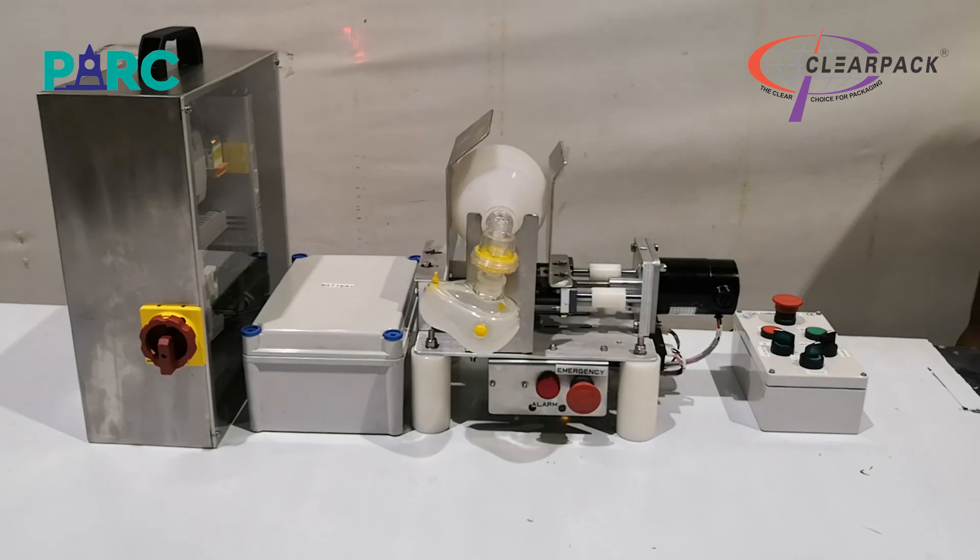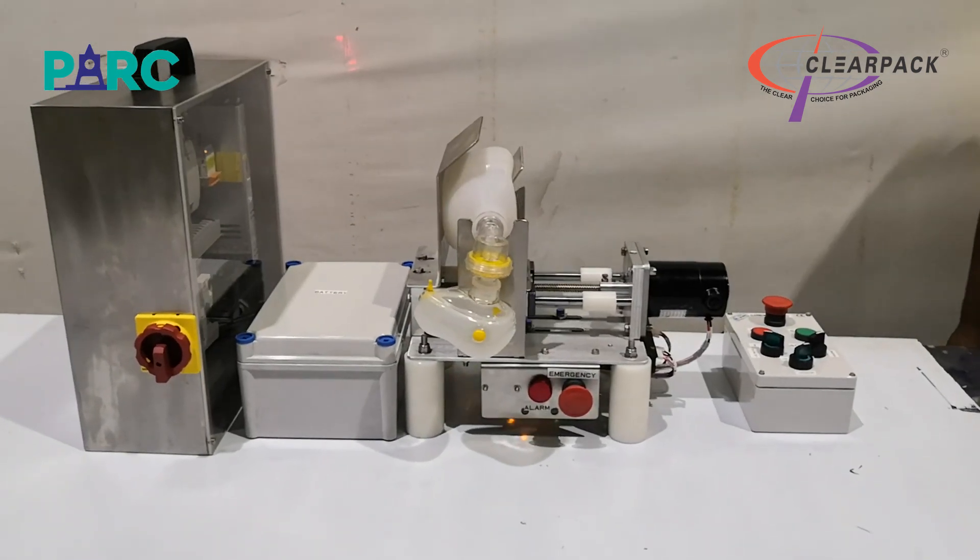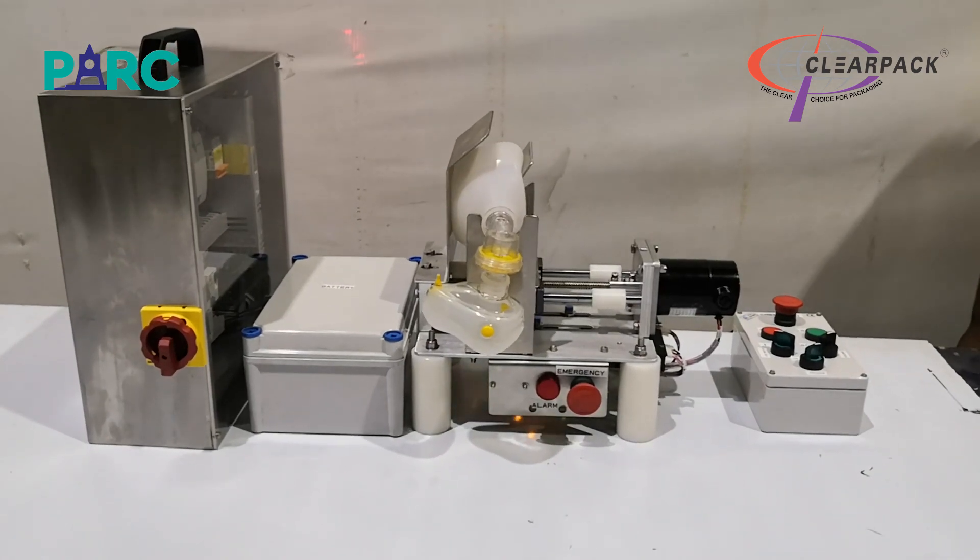We are confident that this respirator will help in situations where the scarcity of clinical ventilators is an issue and some form of short-term respirator support is needed for the patient.